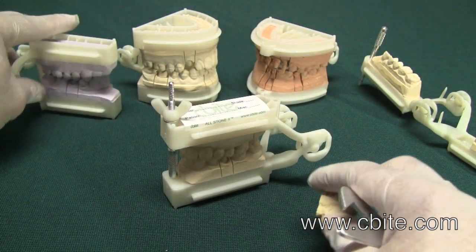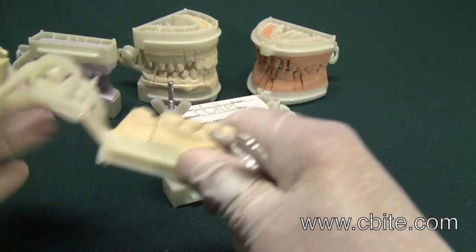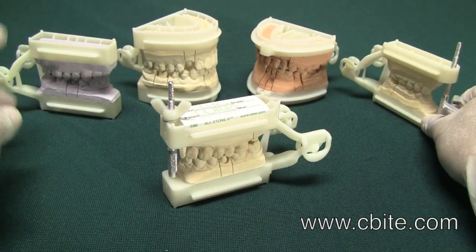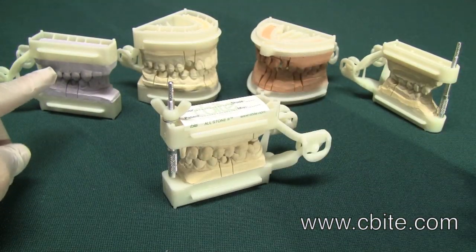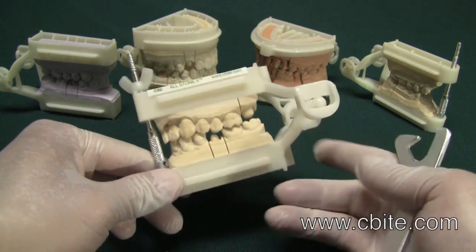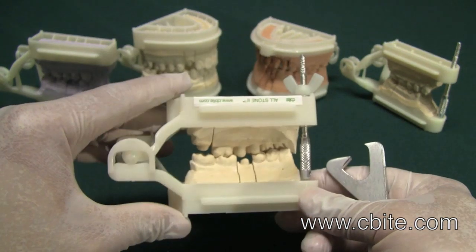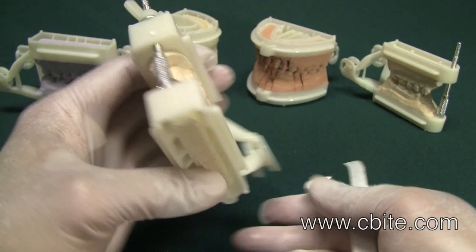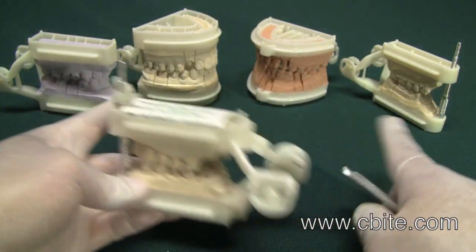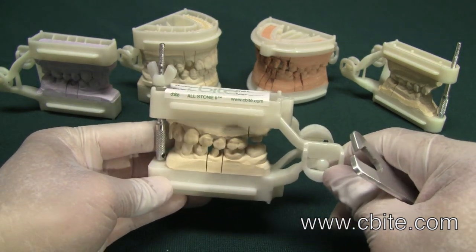Those are the key differences between the original Allstone, the Allstone 2, and the Allstone Neo. The Allstone Neo is really the best product of the Allstone family — we have combined the features of both into one. Our customers are very, very happy with this design.